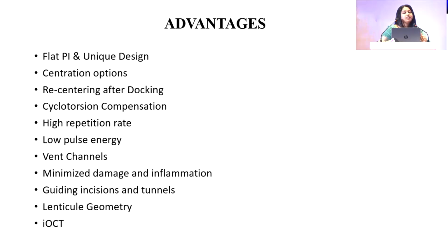Finally, the lenticule geometry. The lenticule trajectory is made here for the resection. There's an incorporation of the Q factor which helps us to respect the preoperative and postoperative corneal surface. And the lenticule profile as such has very tapering ends at the periphery without the side cut, which ensures that the effective optical zone, the functional optical zone, is quite large, which helps in decreasing the spherical aberration, which helps in better visual quality in low light illuminations.